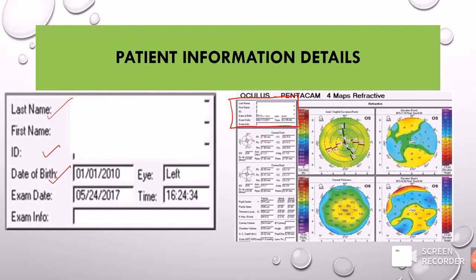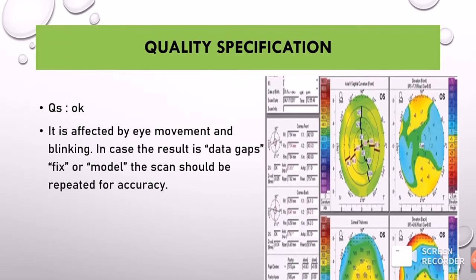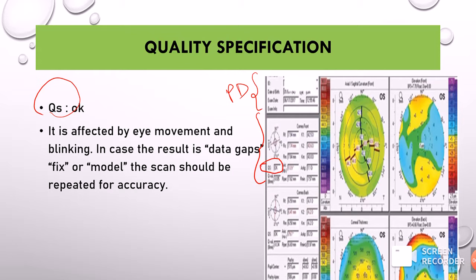Date of birth is very important because the Pentacam will be comparing it with age-related controls and other normative data. Next, we have the quality specification. The quality specification tells us about the quality of the scan and is written as QS. If QS is okay you can proceed with the scan, but sometimes there are results like data gaps written as 'fix' or 'model,' which means the scan is not of good quality and you need to repeat the scan.